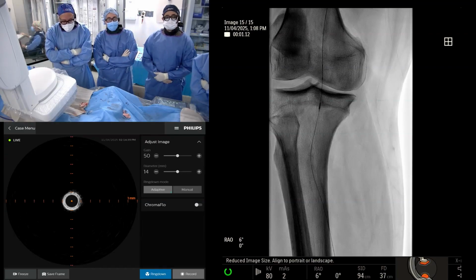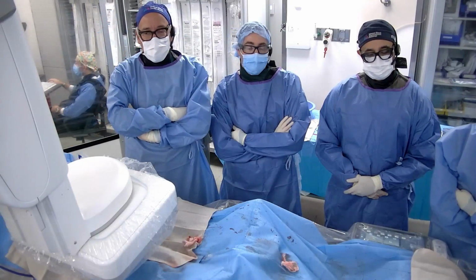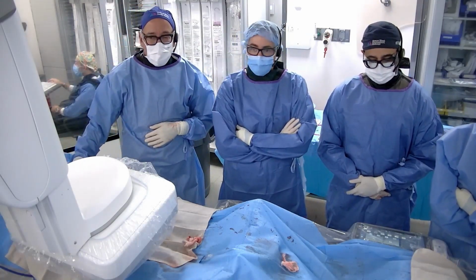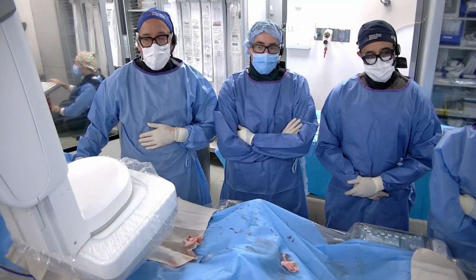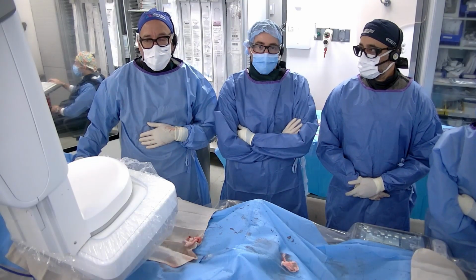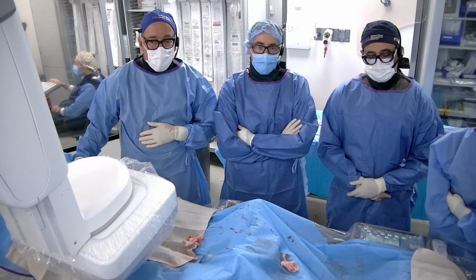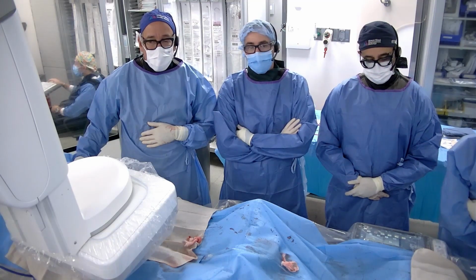Jeff? Yeah, I think the Spur's a good idea, but if you don't have it, I would put a drug-eluting stent in there. Yeah, I think it really needs scaffolding with that eccentric calcium. I don't think we have a suboptimal PTA. Drug-eluting versus bioresorbable, I mean, coronary, either stent would work if you have either of them. Jay? Yeah, I want to see what happens after the aspiration and then reevaluate. I agree with Jay. I want to see what happens after the aspiration because the flow is better. Hopefully we can get away with drug-eluting therapy without having to leave a scaffold.